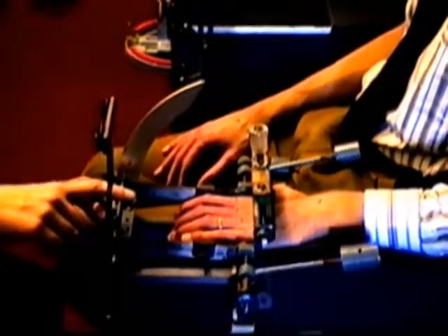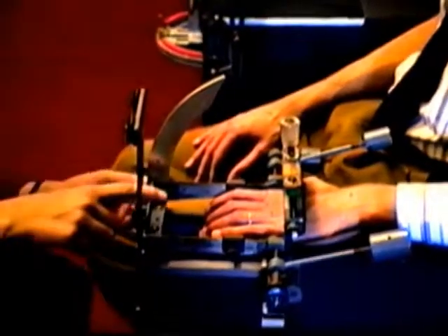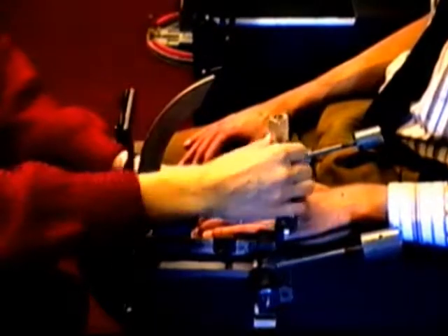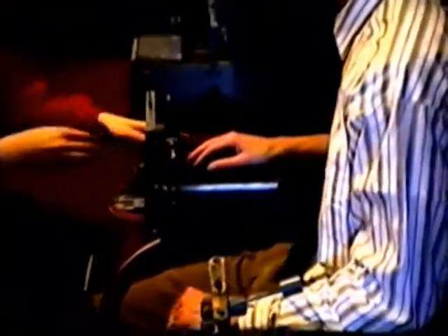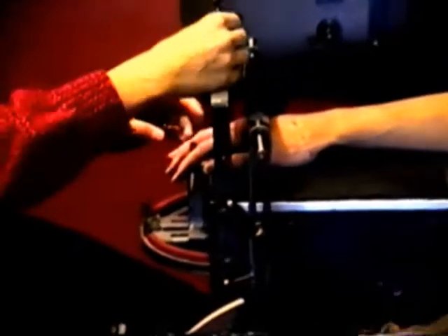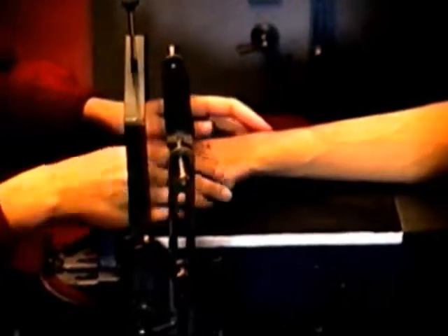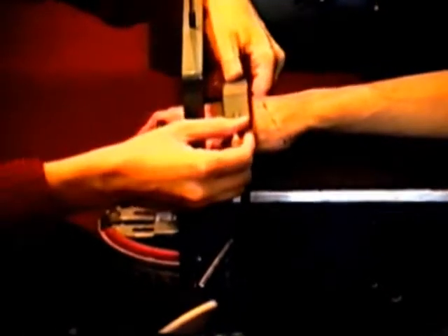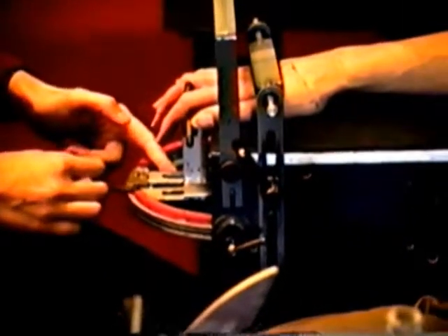And we thought about the problem, how to do it fast. She's arranging the hand according to the reference points of the joints.